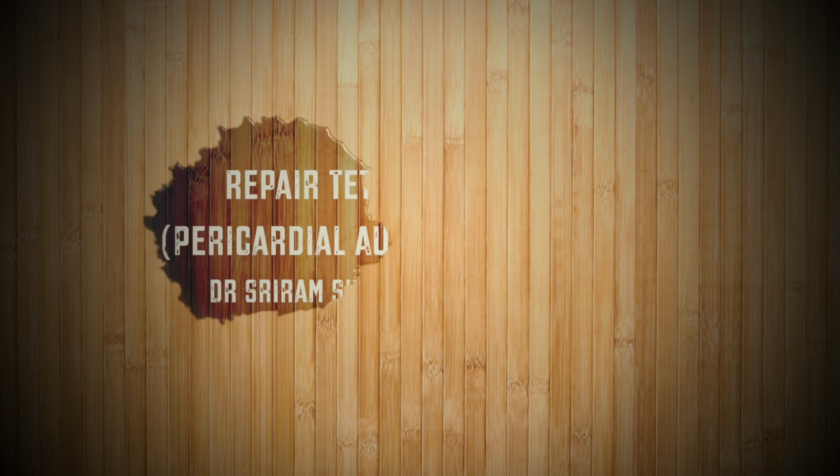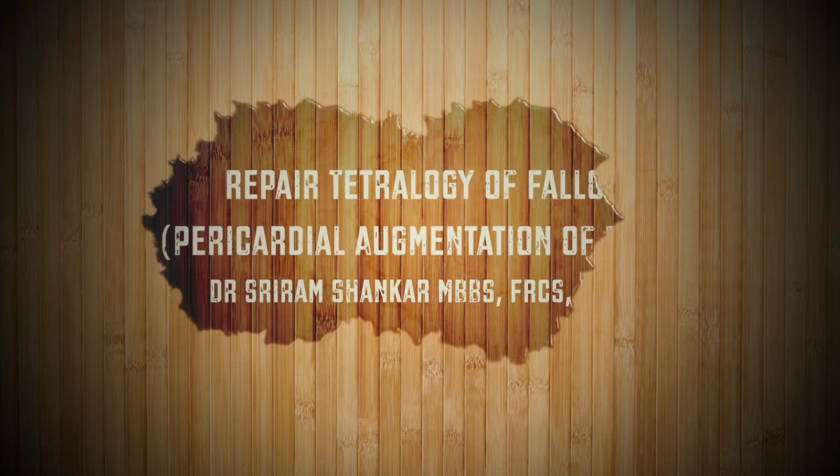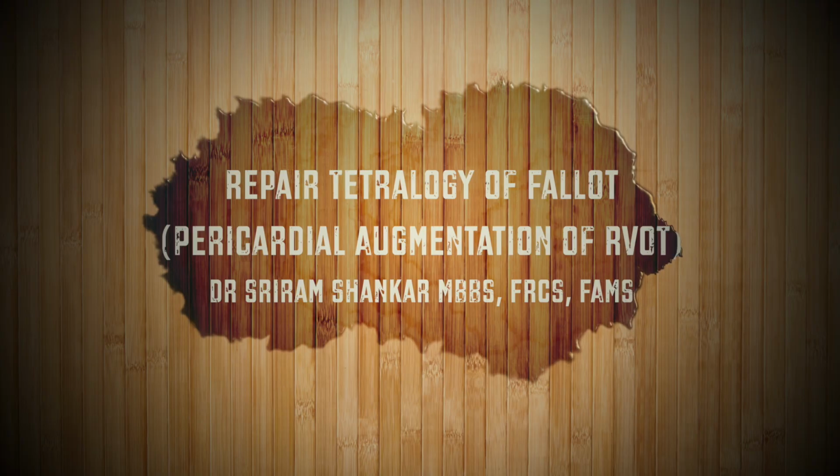This patient has Tetralogy of Fallot requiring surgical repair. This video shows a surgical procedure. There will be cutting and sewing of live human tissues, and blood and other human bodily fluids may also be visible. Viewer discretion is advised.